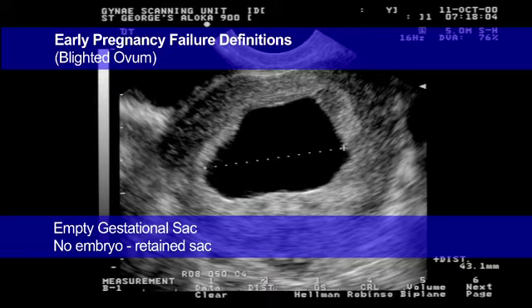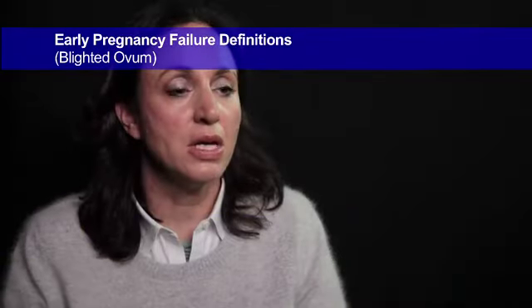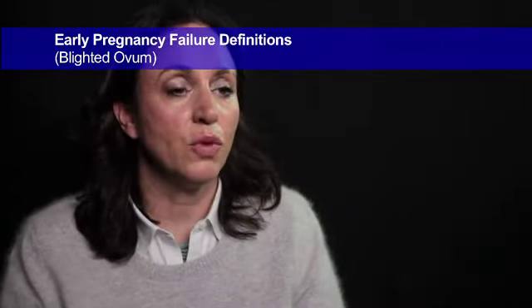This represents a very early fetal demise, and perhaps the early embryonic tissue has been broken down and is no longer visible on scan. I would like to emphasize that one must always check these findings at least 1 week apart, 7 days apart, to ensure that one is not, in fact, misinterpreting an early pregnancy.